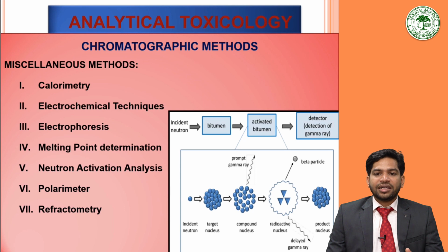So, the disadvantage with this method is that a nuclear reactor is required, that is high cost equipment, and trained staff is also required, and it is a slow process because of the time required for the irradiation, cooling and the study of the emission spectra. Because of these difficulties, neutron activation analysis has now been replaced by flameless atomic absorption spectrophotometry, FAAS mainly.